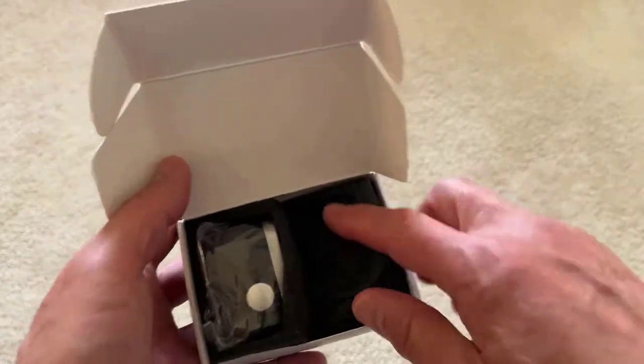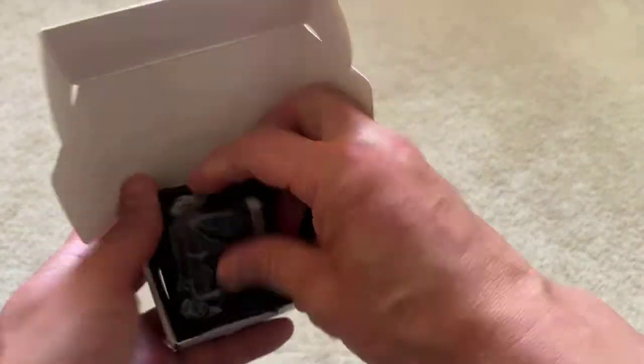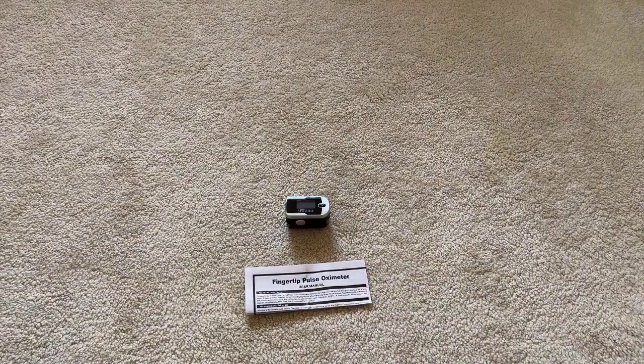Let's see what's inside. In the box you get the fingertip pulse oximeter, a neck/wrist cord, a user manual, and two AAA batteries. You can supposedly get 30 hours or more on one set of these batteries.